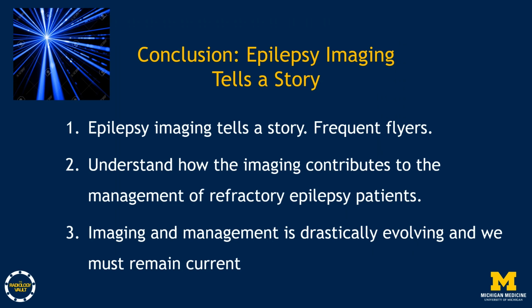These patients are frequent flyers in the Department of Radiology. It's important to understand how the imaging contributes to the management of patients with refractory epilepsy. Imaging and management is drastically evolving, and we must remain current with new technology and surgical approaches and clinical data.